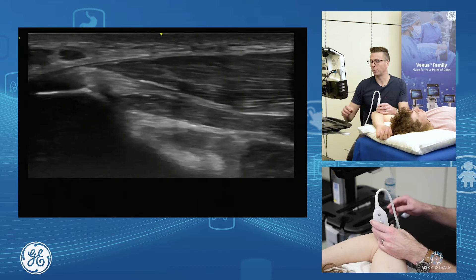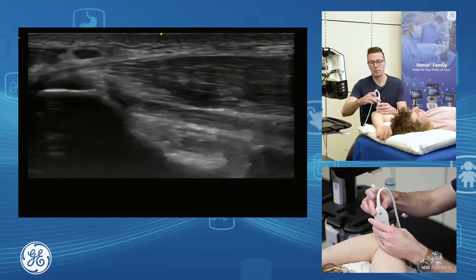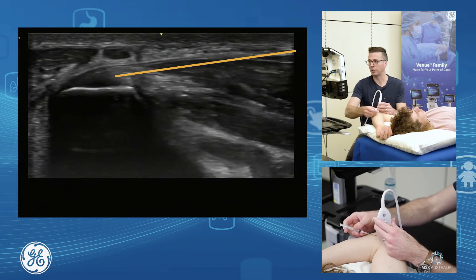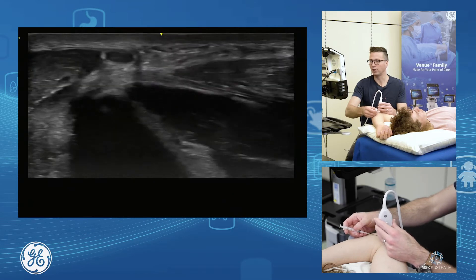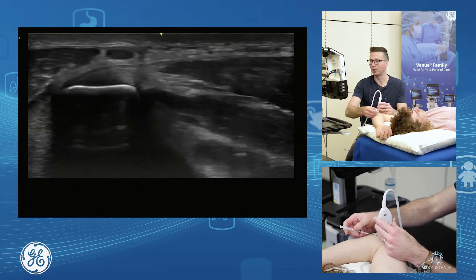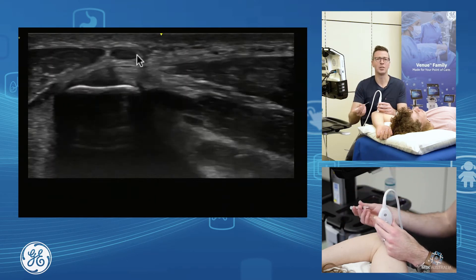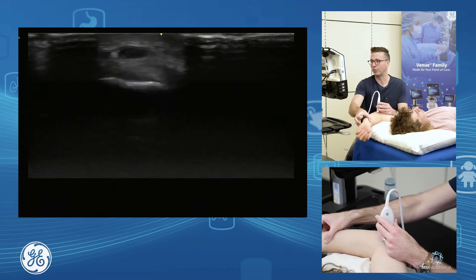To inject your common flexor, I'd move myself around and come up through here, bringing my needle in through here to inject. The thing you'd want to be aware of is what's happening with the ulnar nerve — we'll talk about that in a minute. In this position, the patient's ulnar nerve is sitting right on top, so you try not to hit that when you're injecting.